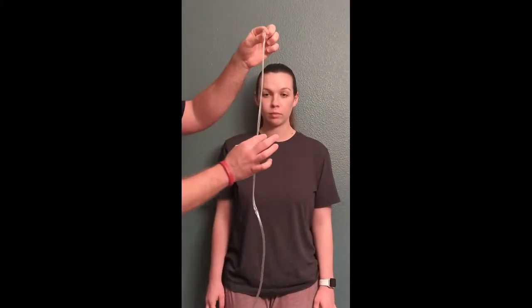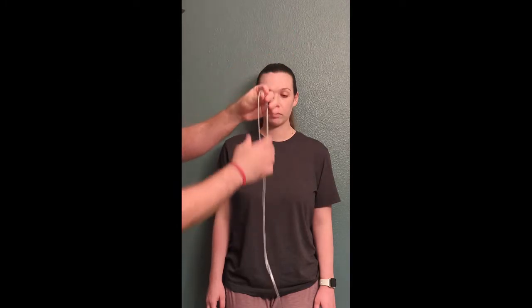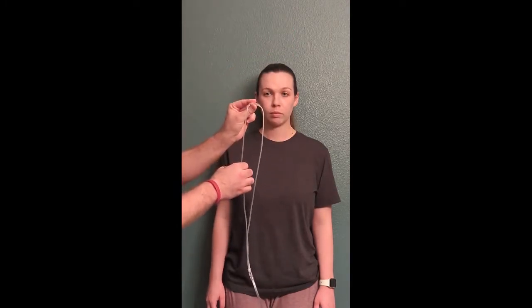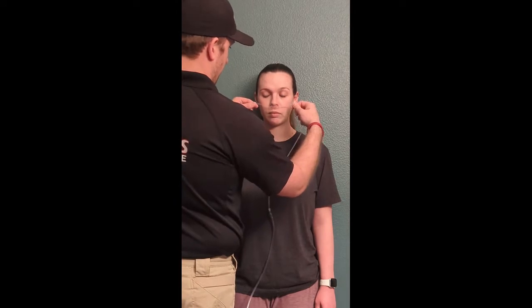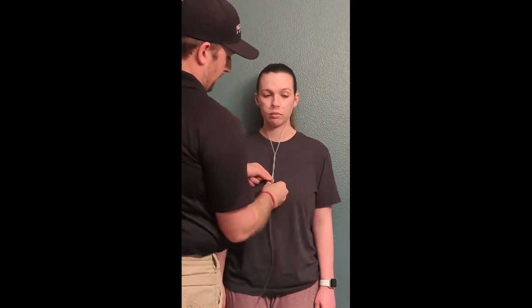Step one is to lower the securing ring all the way. Two is make sure the prongs are facing the right direction. In this case, these are the curved prongs, so we want to point towards the patient's feet. Place them in the nose, around the ears, a little bit of downward force, and then secure.